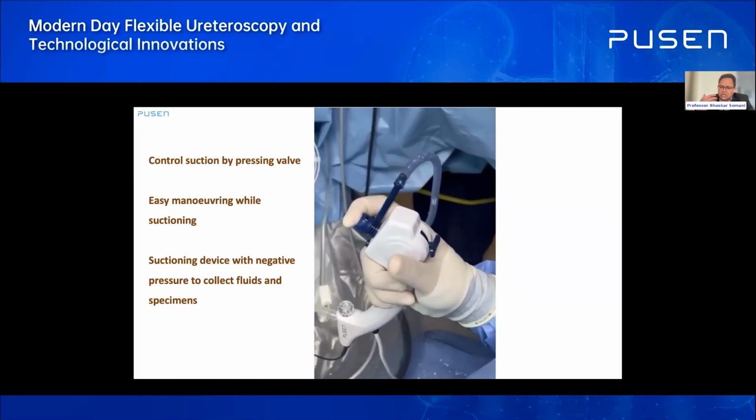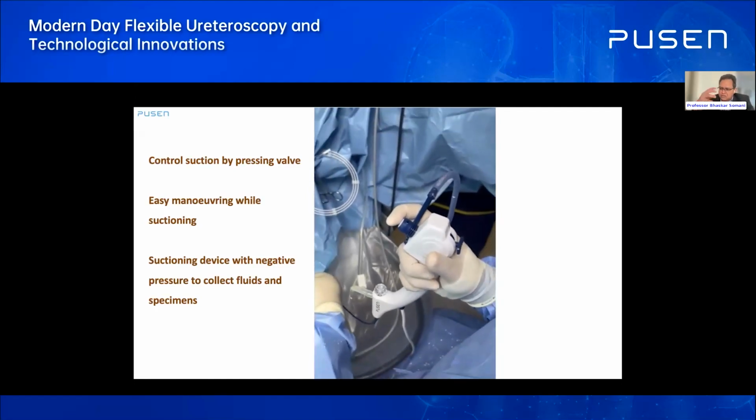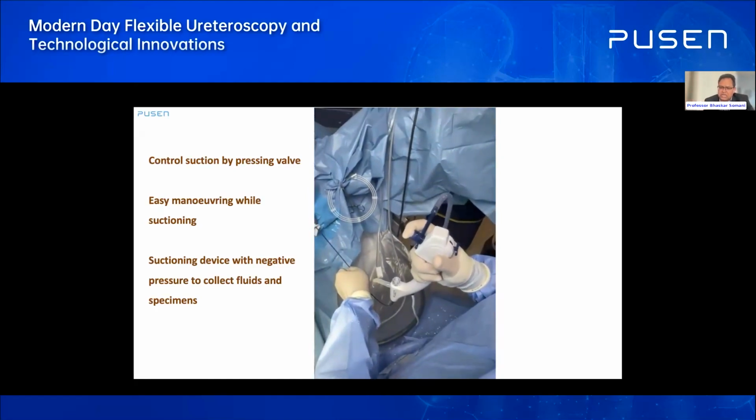And you know, all this worry about negative suction and are you going to cause bleeding, etc. I've now done about 7 cases and I've not seen it in any of them. I don't think that's a big worry, really.